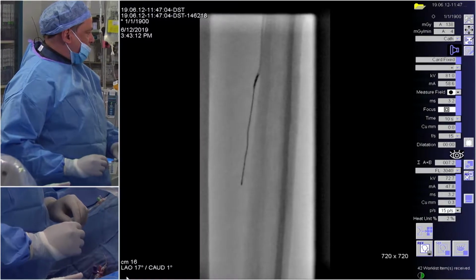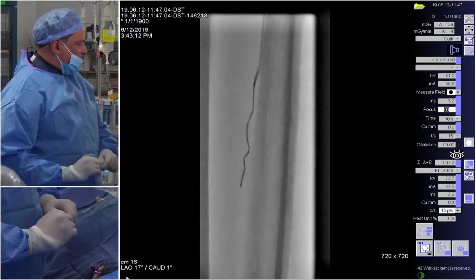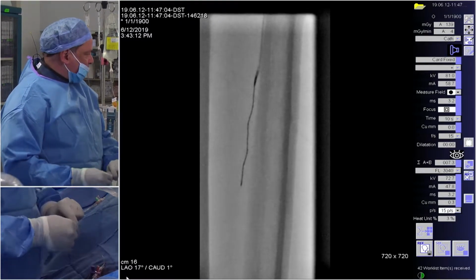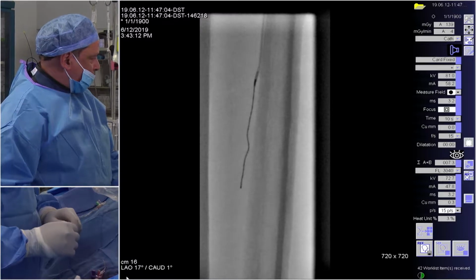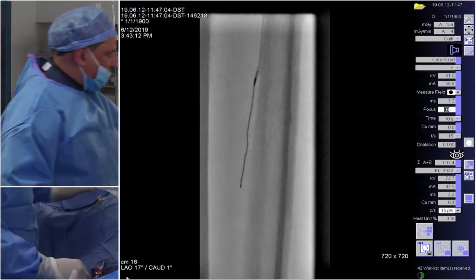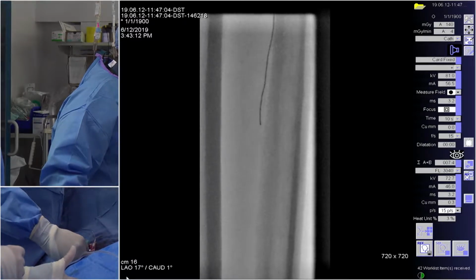But you know, this is actually a great demonstration. I would say that sometimes in antegrade approach, I mean, we'll talk about the CTOP trials and the predictors, but can you tell us in your mind, and I think it's very thoughtful, it's very important points what you mentioned, what were your concerns about retrograde pedal access in this case?